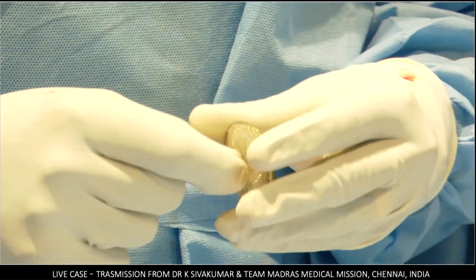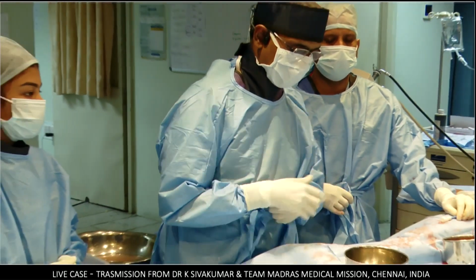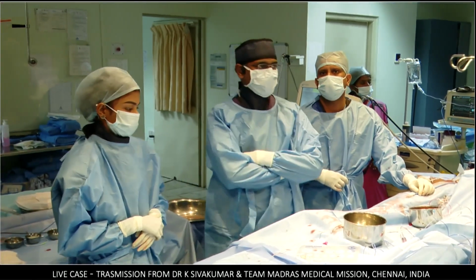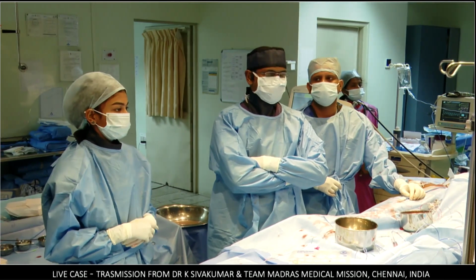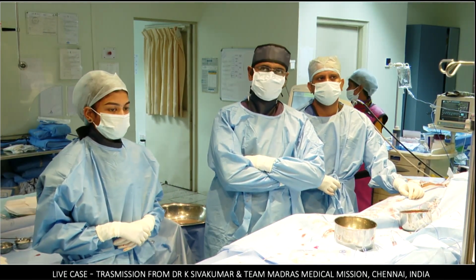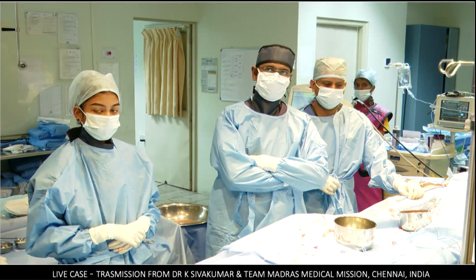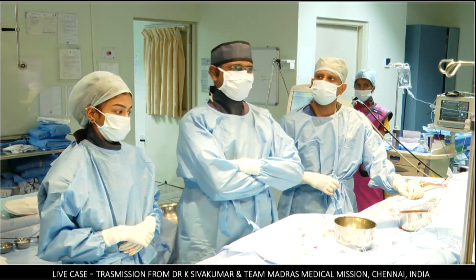So whilst you're doing that, Shiva, one obvious question is, if in the defect that you're closing you get the wrong waist, if you like, so the bigger waist but you needed the smaller one, would that stretch the device too much?